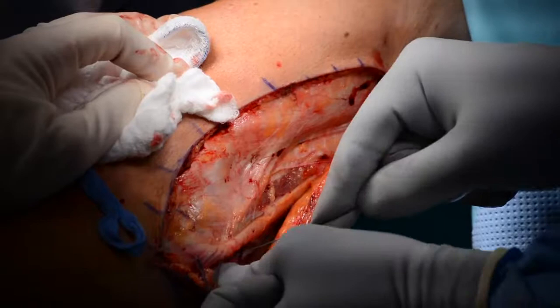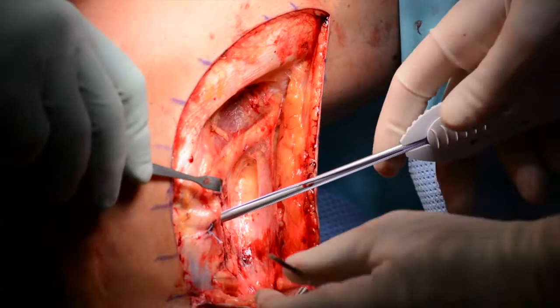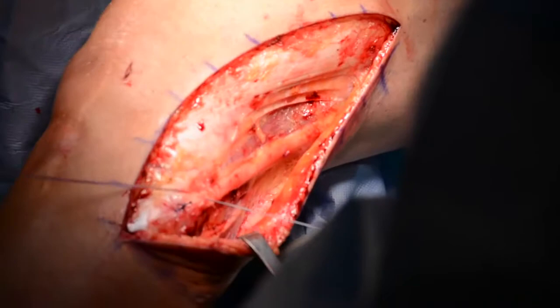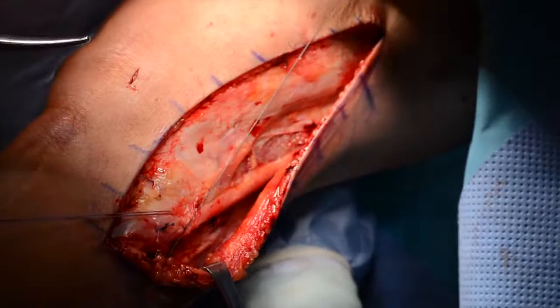The biceps femoris should then be checked for proper restoration of its anatomic positioning. If stabilization is inadequate, a third Mitek suture anchor may be used to reinforce the biceps femoris attachment to the fibula. The sutures are then once again passed through the long or short head of the biceps femoris for greater stabilization, and the sutures are tied with the knee in full extension. This repair can then be reinforced with a number zero Vicryl suture.